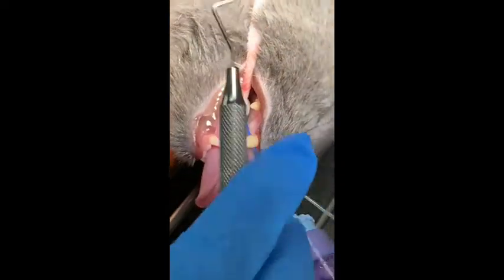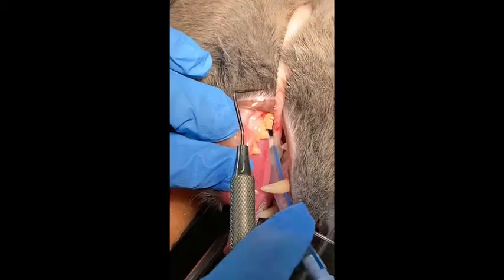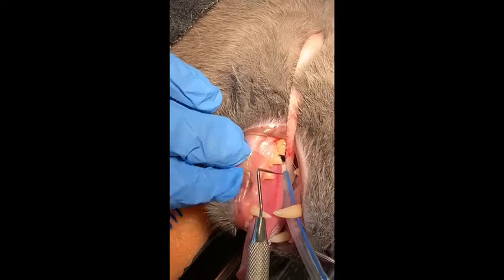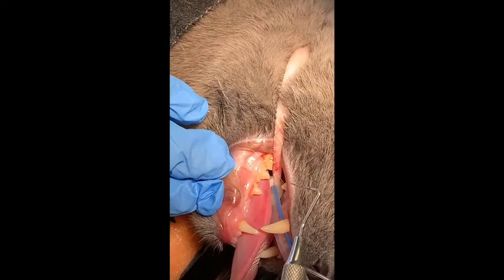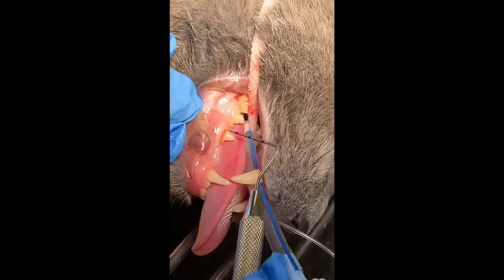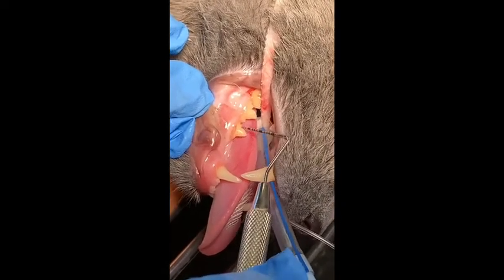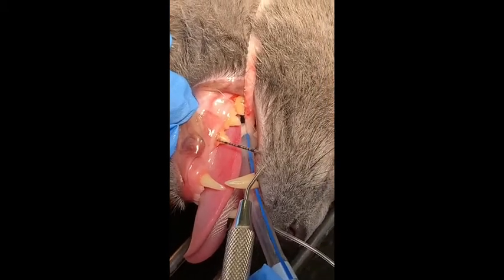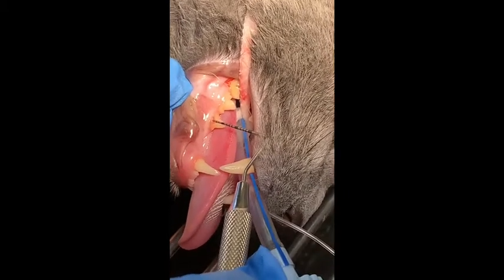Then we're going to go to the mandible, which is the lower jaw here. So the premolars, which are here. So this is premolar 1, which is number 407. Again, going around with the periodontal probe, checking the whole circumference of the teeth. And I would say that is about 0.5 millimeters.